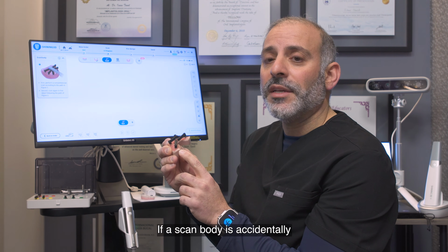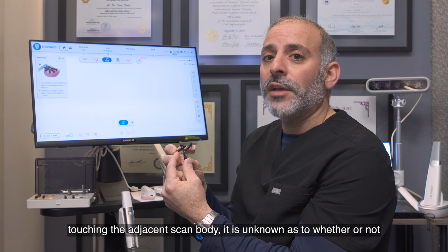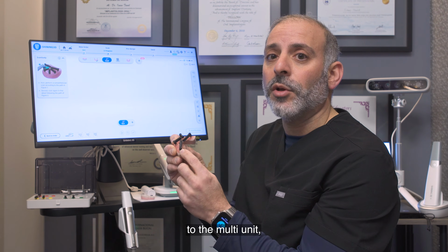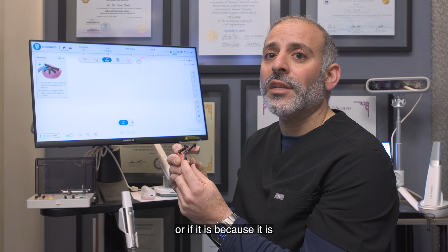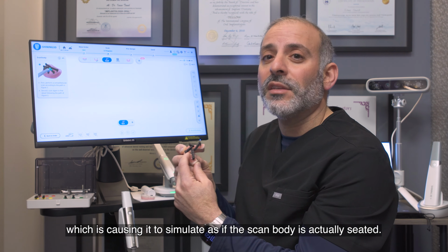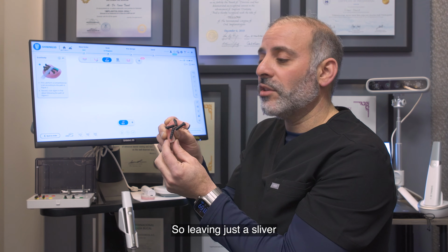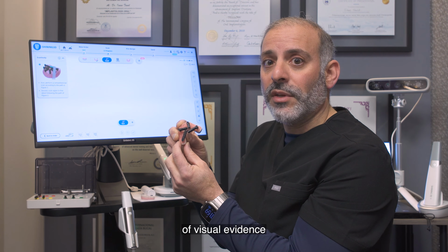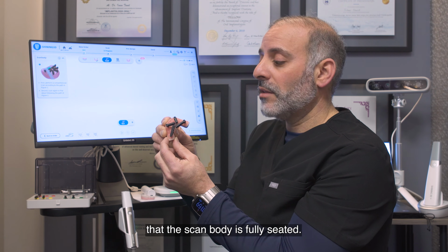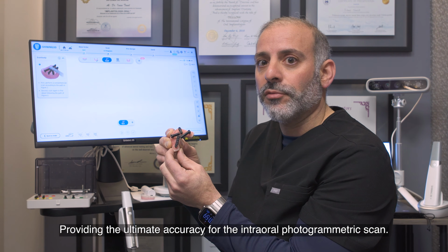If a scan body is accidentally touching the adjacent scan body, it is unknown whether the scan body is sitting down and being locked in by the screw to the multi-unit, or if it is butting up against the adjacent scan body flag, which is causing it to simulate as if the scan body is actually seated. So leaving just a sliver of visual evidence that the scan bodies are not touching each other ensures that the scan body is fully seated, providing the ultimate accuracy for the intraoral photogrammetric scan.